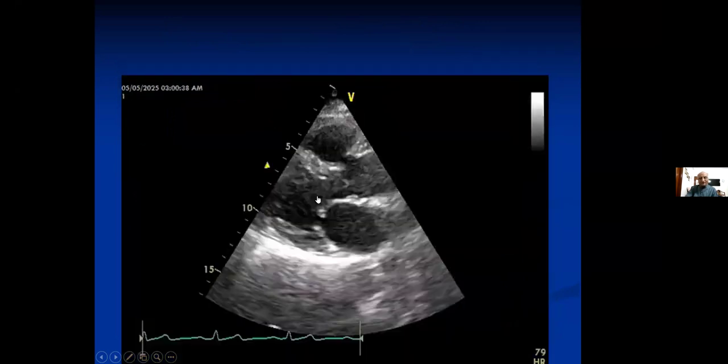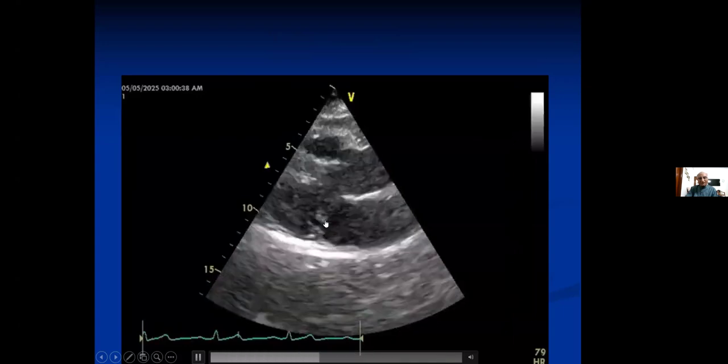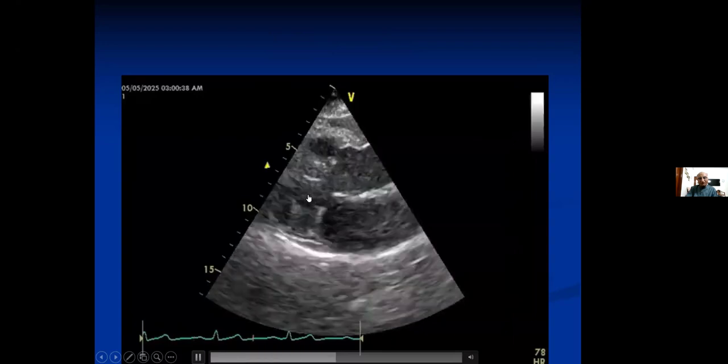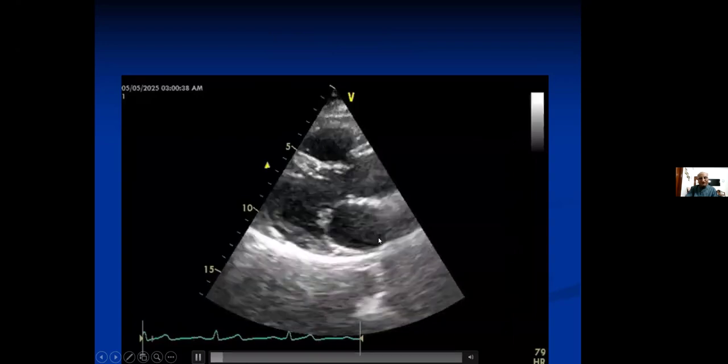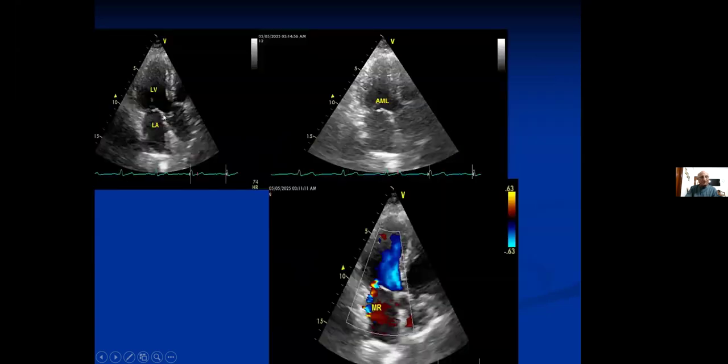Now, how did this help us? This is one case we had a few days back. There was doming of the mitral leaflet. You can see in the anterior mitral wall, it shows the doming, but no other features were present. And when we did the same thing, surprisingly, you see the A wave of the posterior leaflet and the A wave of the anterior leaflet move in the opposite direction. They do not move in the same direction. So we felt that this is a false positive doming, and this turned out to be because of a partially flail mitral leaflet, and this was giving the appearance of a doming with eccentric MR. So just an incidental thing that all doming may not be pure stenosis.